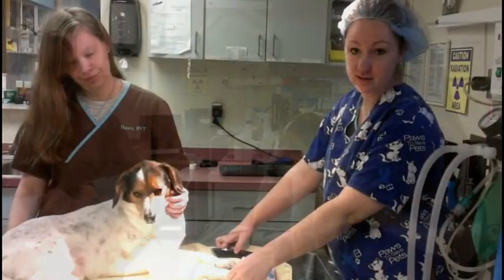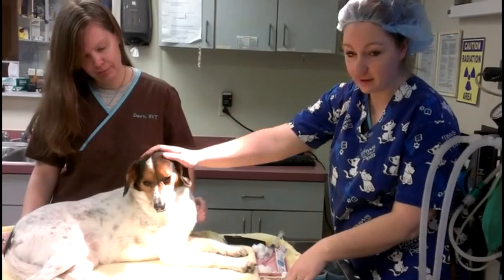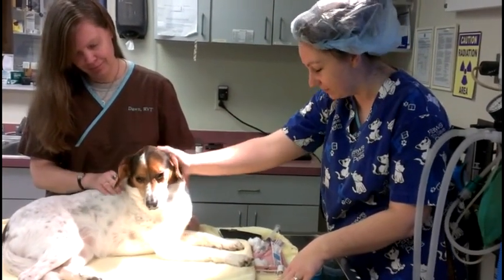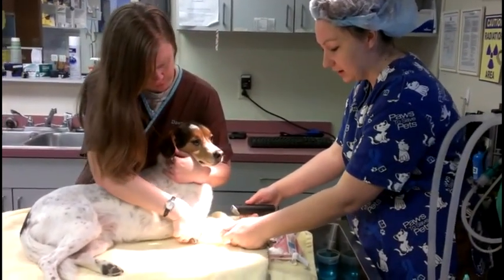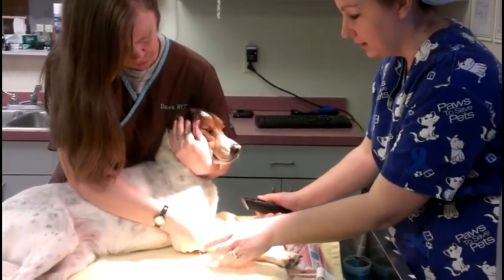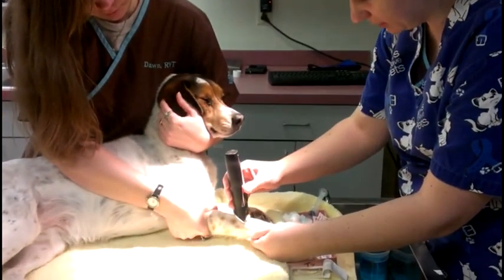We're the registered technicians here at Suburban Animal Clinic, and I'm going to be doing Mabel's dental today. As you can see, she's feeling the effects of her sedation. She's a little bit calmer, a little bit sleepy. So what we're going to do now is put in an IV catheter, and that just gives us a way to give her her anesthesia and also to give her some fluids while she's under, just to keep her hydrated and keep her blood pressure up. So we're going to clip a little bit of hair.